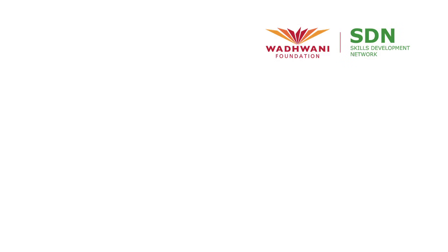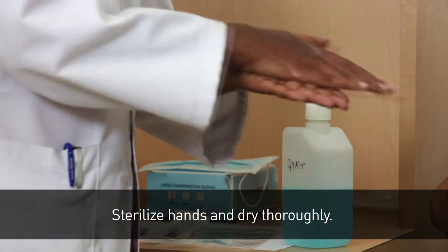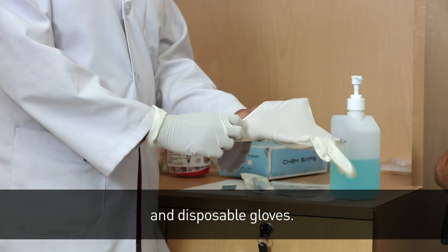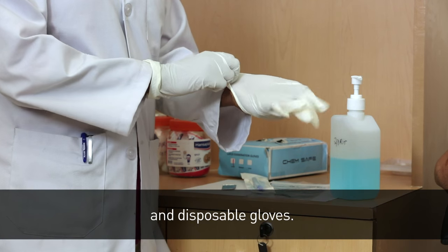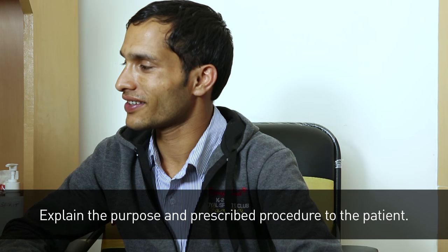Welcome to a video on Pus, Nail, Skin and Hair Collection Procedure. This video is brought to you by Wadhwani Foundation. Sterilize hands and dry thoroughly. Wear mask and disposable gloves. Explain the purpose and prescribed procedure to the patient.